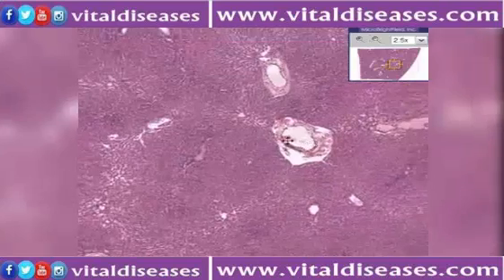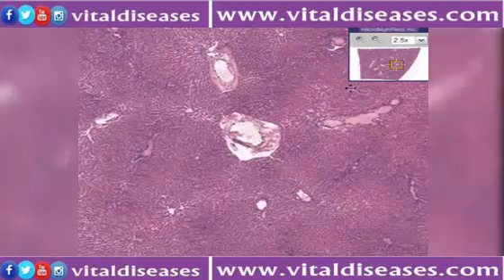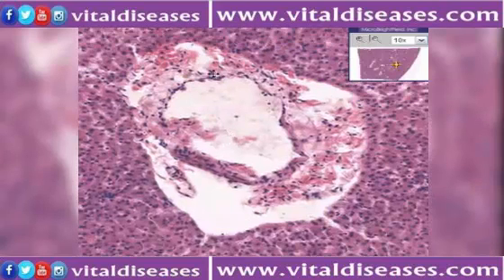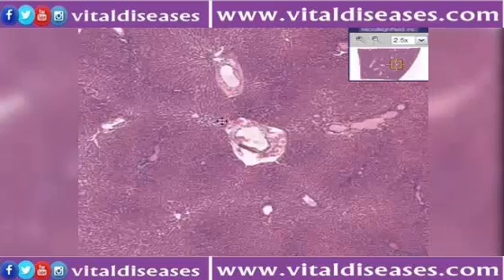But if you see something that doesn't have much connective tissue and looks big, and it's really only a vein, then that's more likely to be a hepatic vein. But once again, if you take a look and there's a little bile duct in the corner somewhere, then I would like to change my theory and probably call it a portal vein.